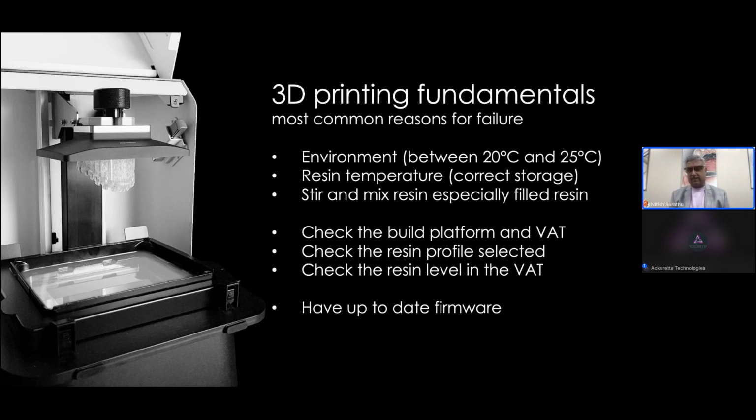And I would do that mixing very gently. Don't vigorously shake the bottle and create a lot of bubbles in the resin itself. But yeah, very gentle shake. Just make sure that the filler particles get equally distributed in the resin base.